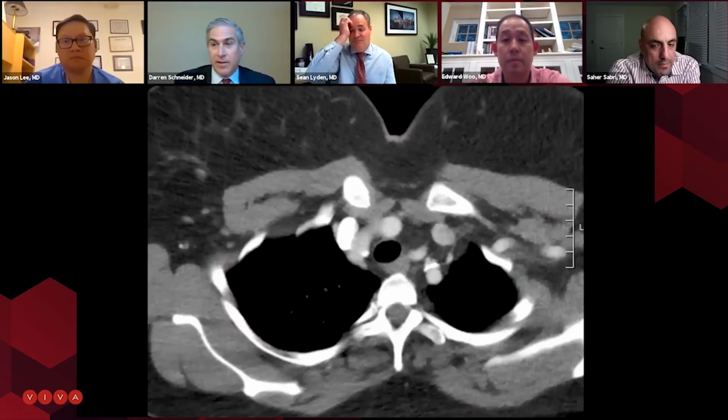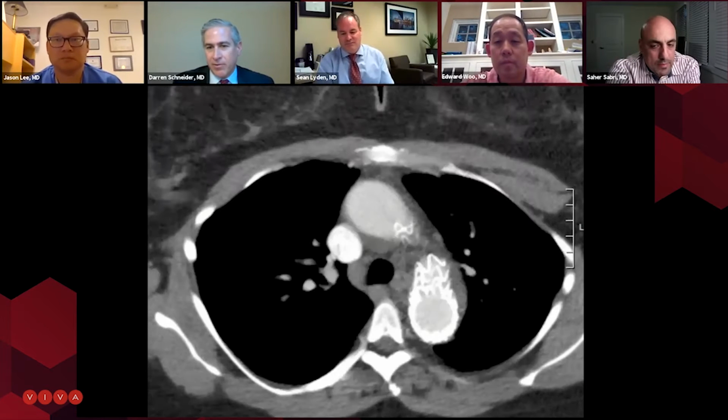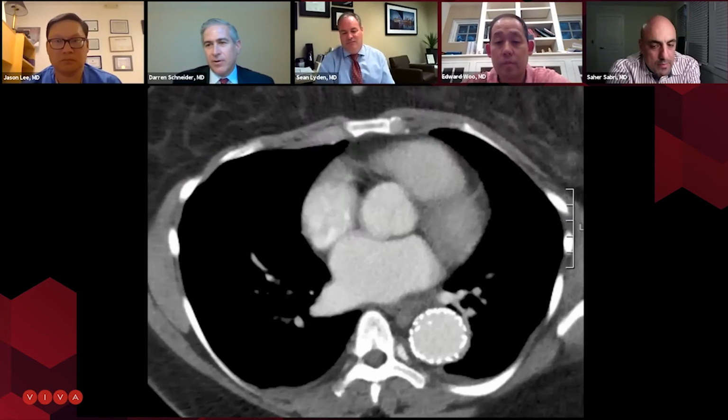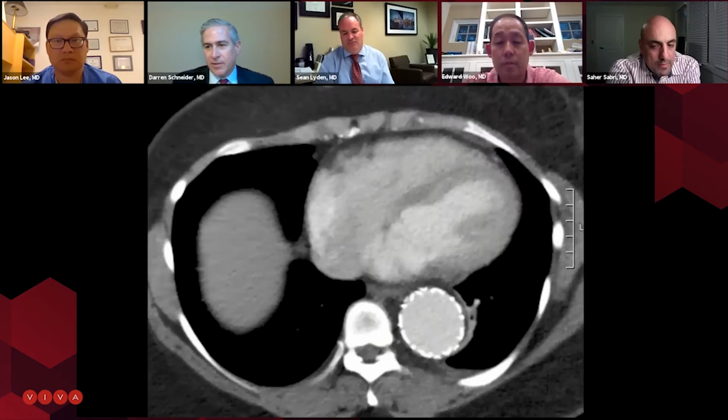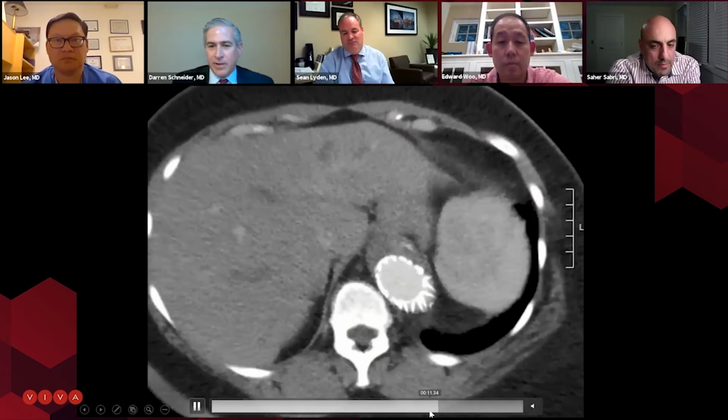I think the other thing is really avoiding that proximal dilation, because not only can you create the retrograde type A, but you could cause the entire proximal end of that device to migrate, and you've got that subclavian branch, that could be a disaster.